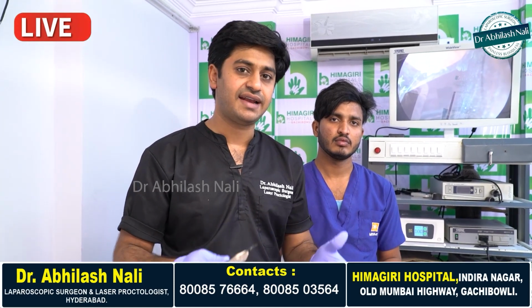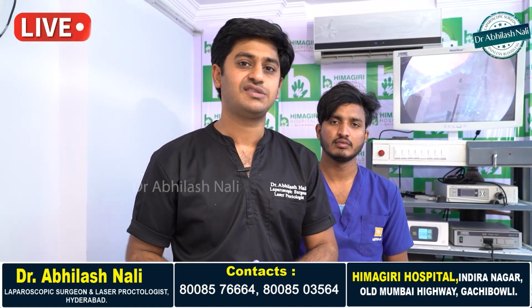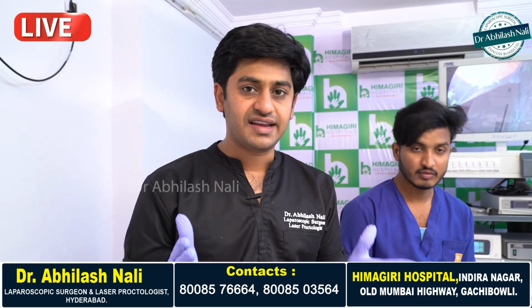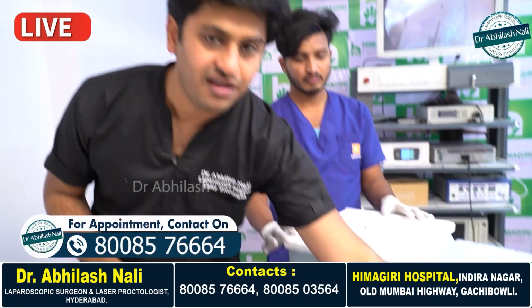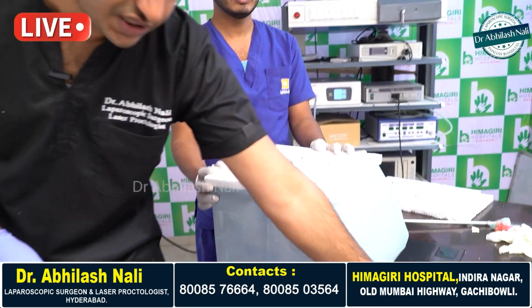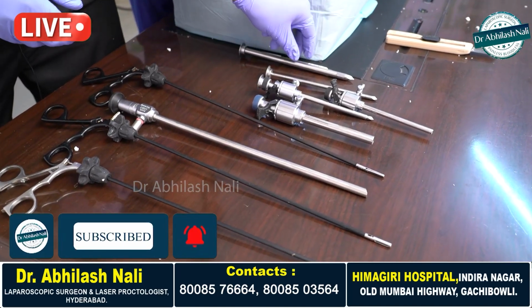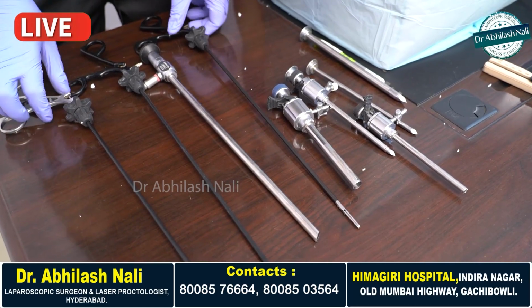But how exactly is a laparoscopic surgery performed, and what are all the advantages of laparoscopic surgery over open surgery? What are all the instruments that are used in laparoscopic surgery? Unlike these knives which are conventionally used in open surgeries, in a laparoscopic surgery we have these called trocars, and these are the laparoscopic instruments.